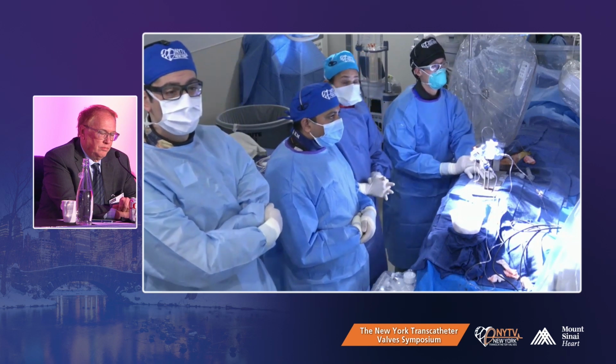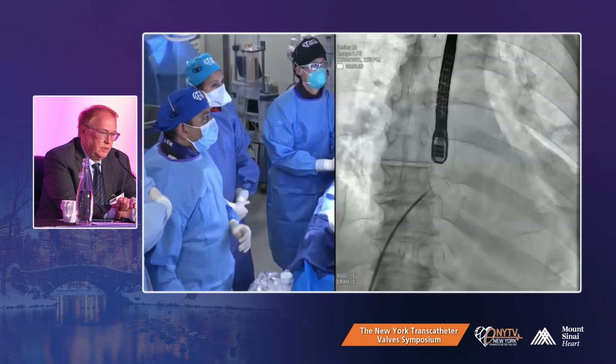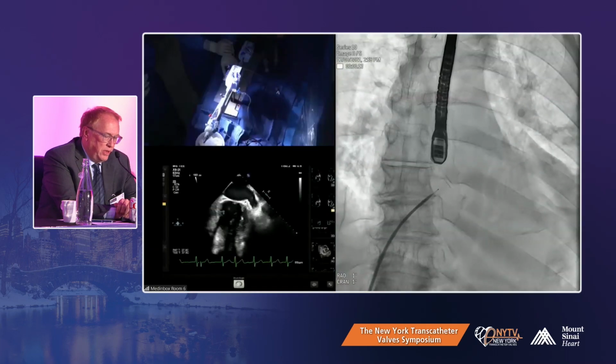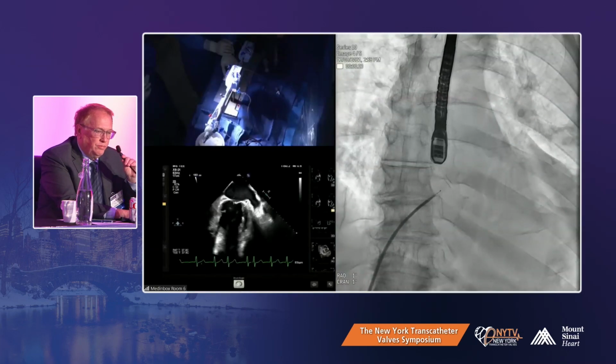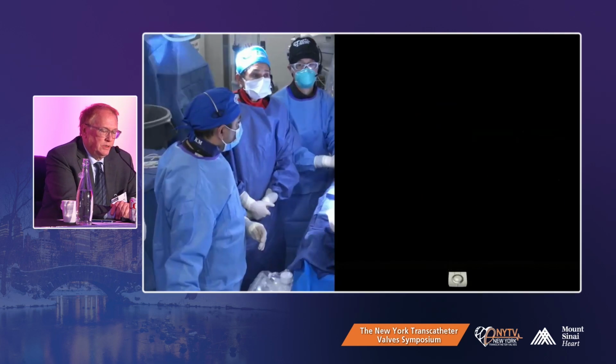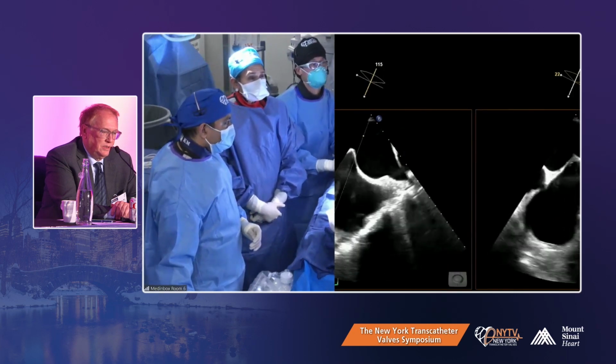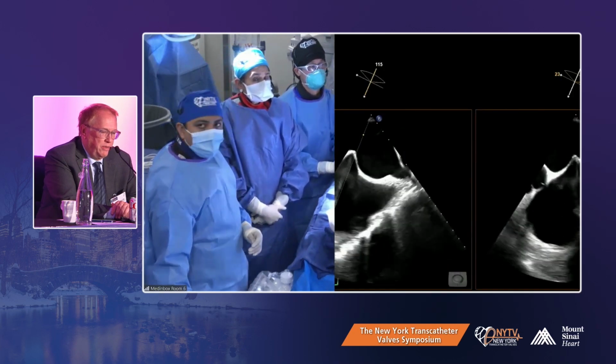Malcolm, show the echo quickly. Having a little trouble hearing you, Anu. Gilbert, I thought I taught you MitraClip. I taught you one thing, and that is you do a posterior puncture. Can you hear me now? That's a little better. Thanks.